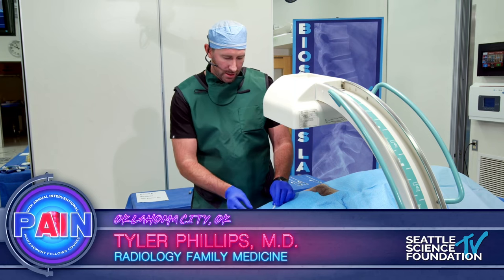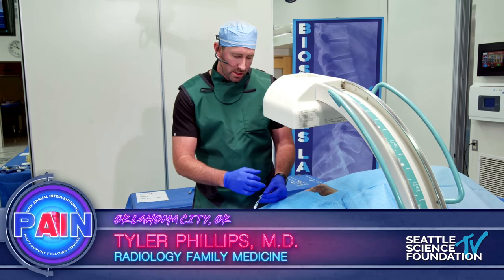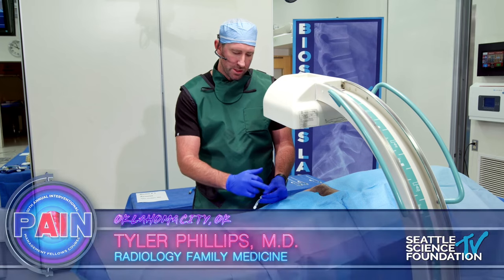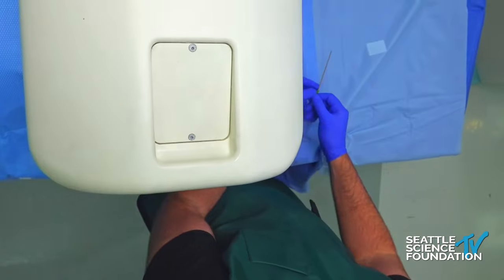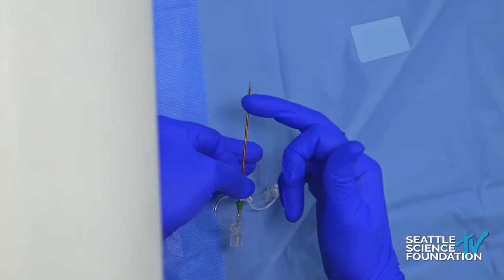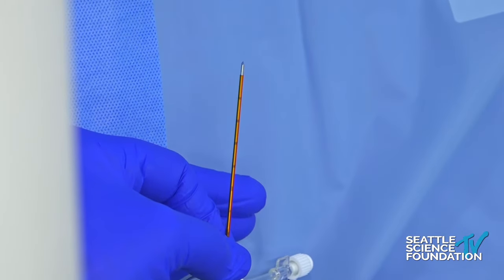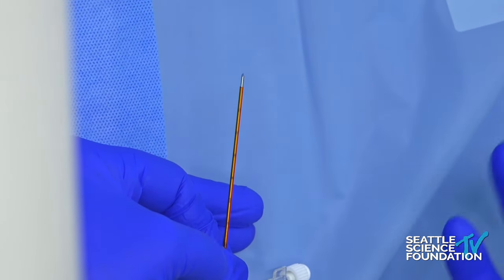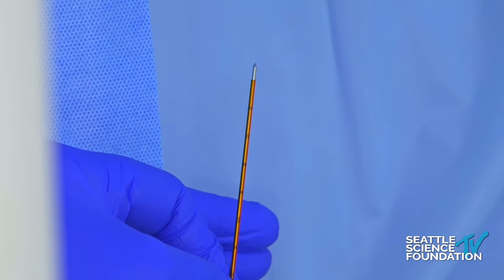The unique feature of this needle is that instead of being along the longitudinal axis, we have a sphere or elliptical shape that extends about two to four millimeters distal to the tip — it extends out past the tip in a sphere. We get a larger ablation size, so when we cover the nerve in these targets we're getting much more reliable results. Instead of having to be along the nerve, we can reliably go down and ablate the nerves that we need to.